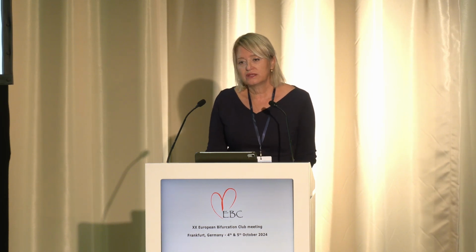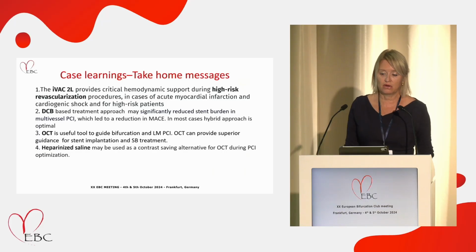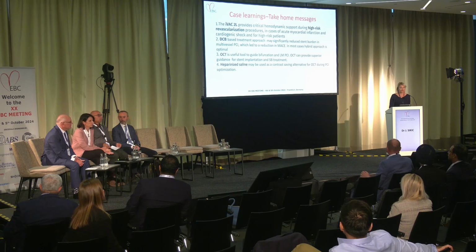And also in the case of low eGFR, we can use heparinized saline instead of contrast to save the kidneys. So that's all. Thank you.